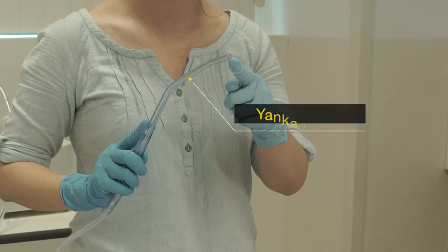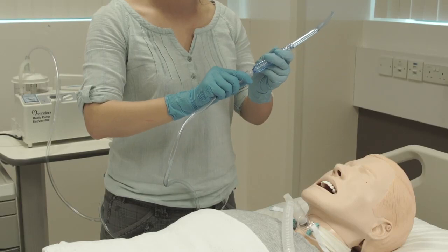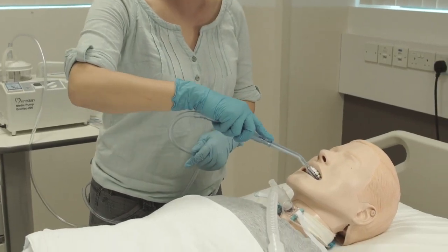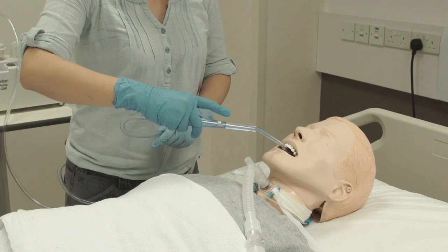You may also use a Yankauer catheter for suctioning of the mouth. The Yankauer catheter is a firm plastic tube with a large opening at the bulbous head. It allows for effective suctioning without damaging surrounding tissues. Connect it to the suction tube. Insert it into the patient's mouth and apply suction by covering the hole. Move the tip around the mouth to clear secretion.